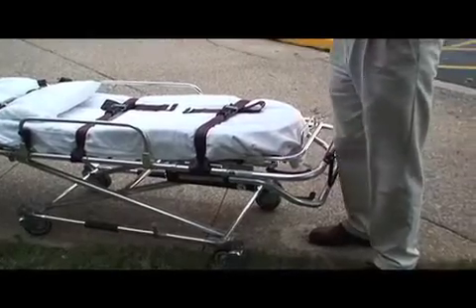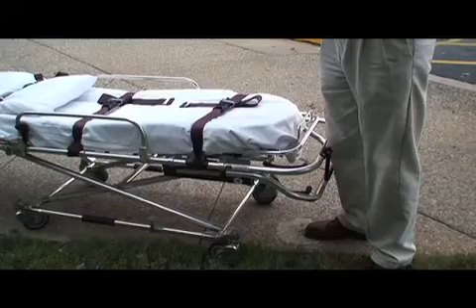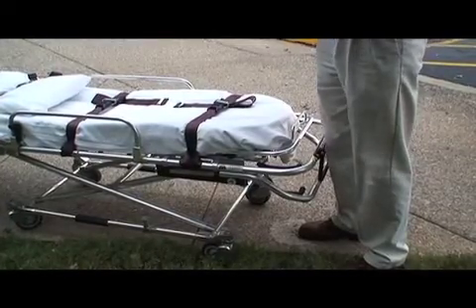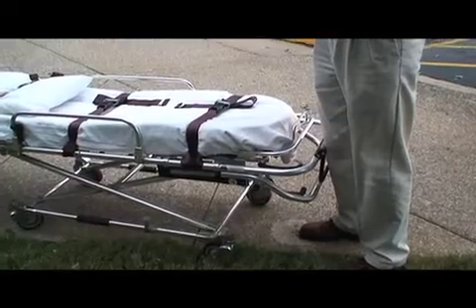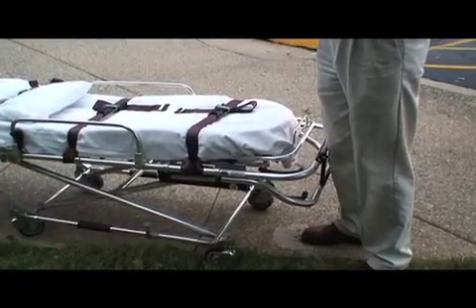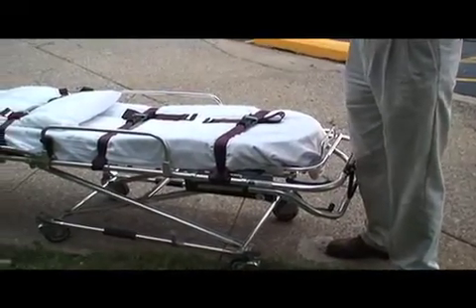Okay? If for some reason you're squeezing the handle and it's not wanting to release, that means that there is too much weight on the stretcher, and if you pull it, it's going to actually fall down. So if you're meeting a significant amount of resistance trying to release the stretcher, then you and your partner are not prepared to hold the weight of what's on the stretcher.